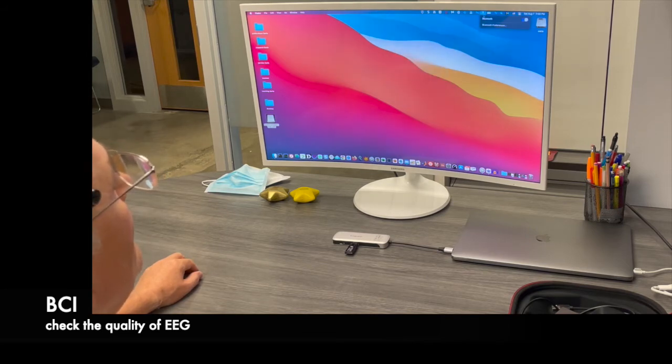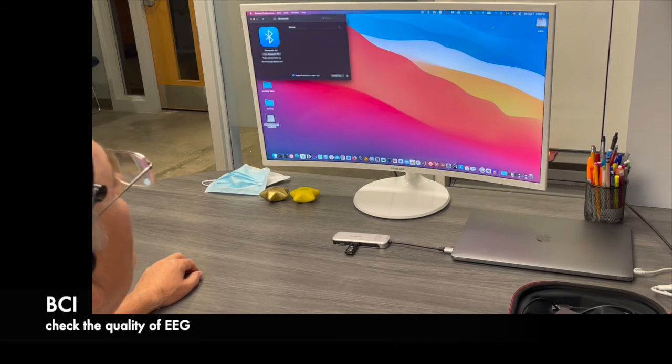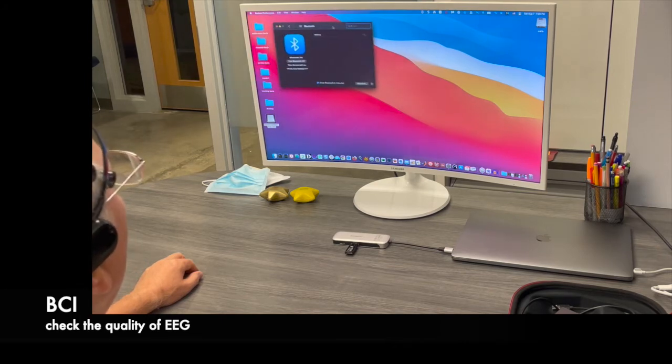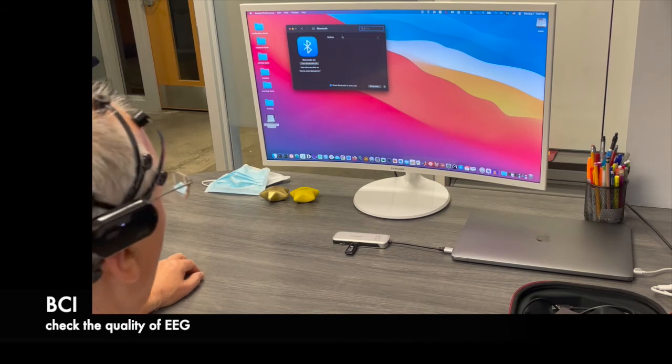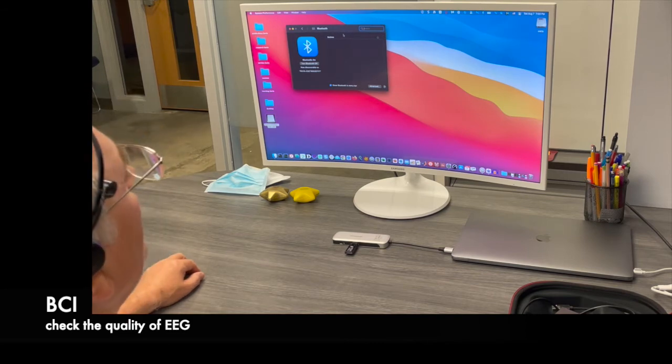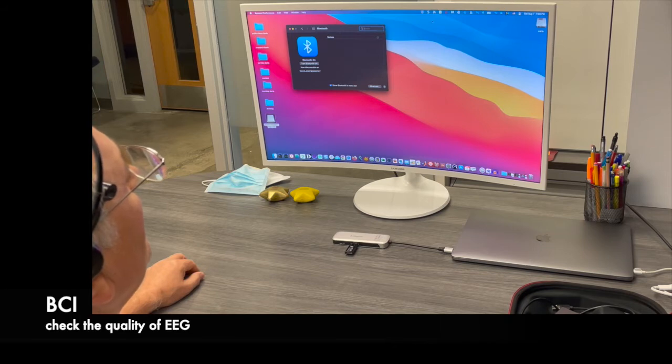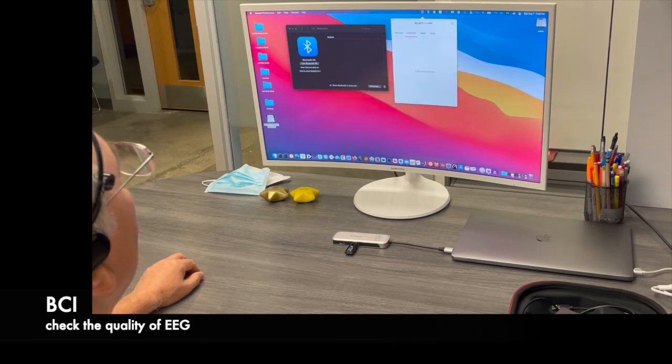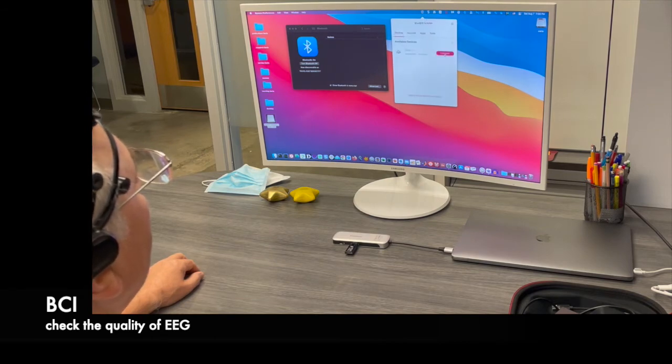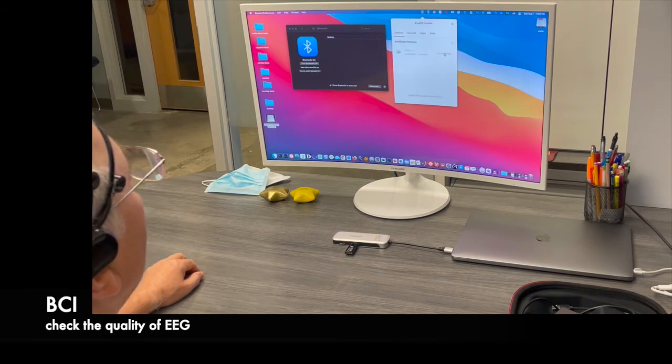And obviously, I need to make sure that the Bluetooth is turned on and that it can discover the unit. And as soon as the unit is discovered, I will see it active in my eMotive software.